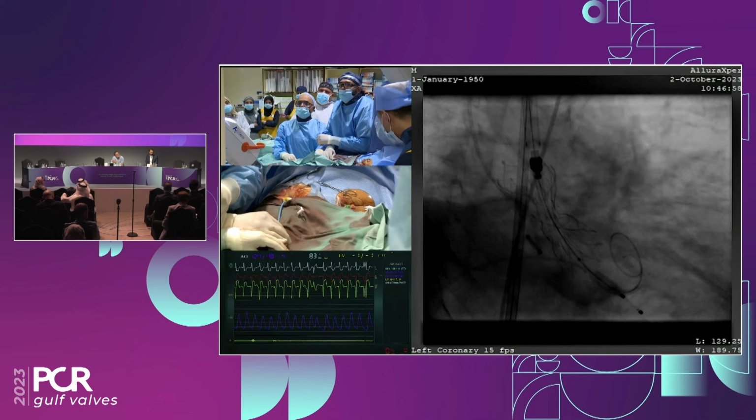This is a bicuspid, and there is a severe calcification. We saw a dent of calcium even in the balloon when he was ballooning. This is all an indicator for enfolding. Also, bigger cell valves are known to have less radial force. This is also a bigger indicator for enfolding.